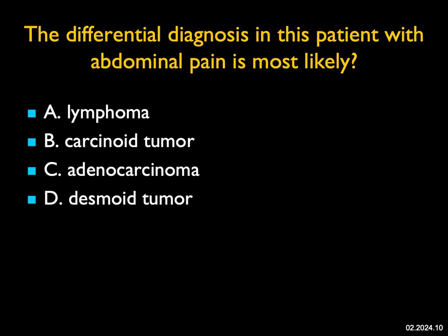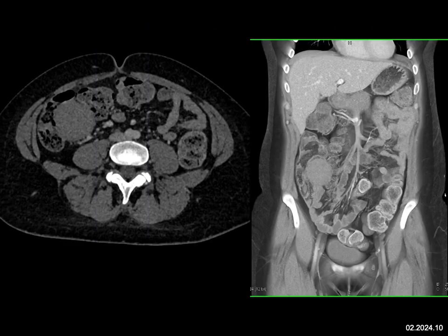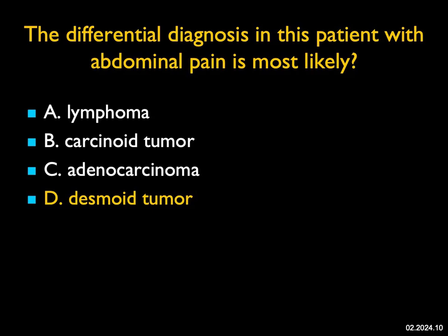The differential diagnosis in this patient with abdominal pain — lymphoma is a possibility, but I don't see any other nodes. Carcinoid tumor can look like this, but they're typically vascular and have a desmoplastic reaction. Adenocarcinoma is a possibility, but this is in the mesentery — adeno typically is within the bowel. A mass that is solid, relatively hypovascular, often without a desmoplastic reaction, is a desmoid tumor. And this indeed was a desmoid tumor. This is a hard case — lymphoma and carcinoids would be reasonable choices, so I give partial credit for those.